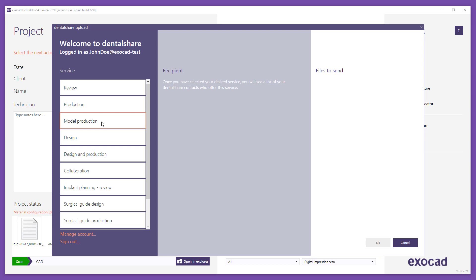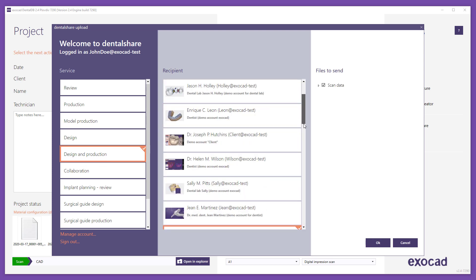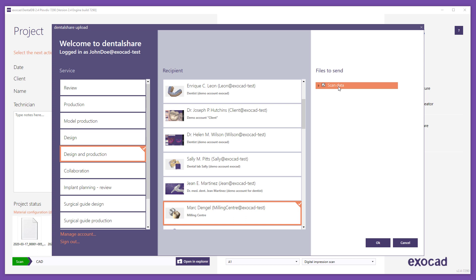After you have selected a service, a list of possible recipient partners is displayed. This list contains your contacts who offer the desired service and are currently accepting data. Select the desired partner by clicking it within the list. After you have selected your partner, a list of data for sending is displayed and the relevant data is selected by default.